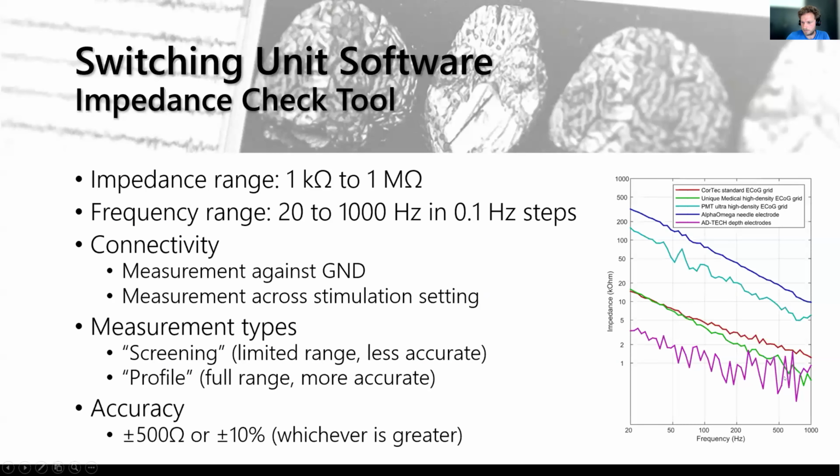I've shown you already the impedance check. Here again, maybe the specs. So we can measure the impedance from 1 kilo ohm to 1 mega ohm. So this is quite a wide range.